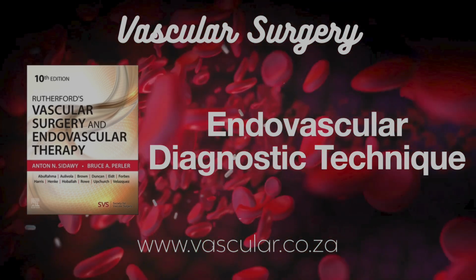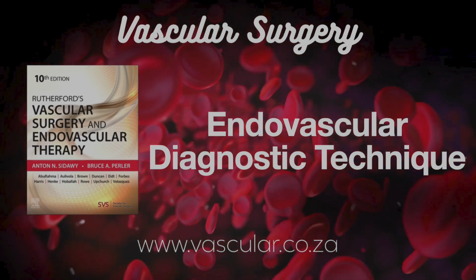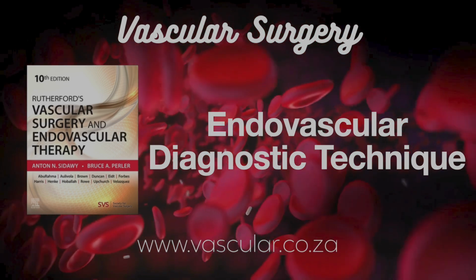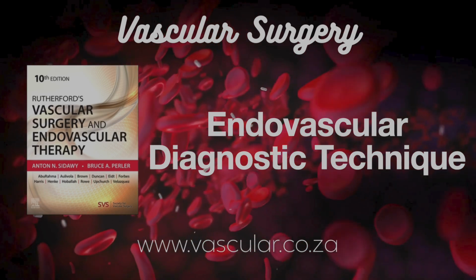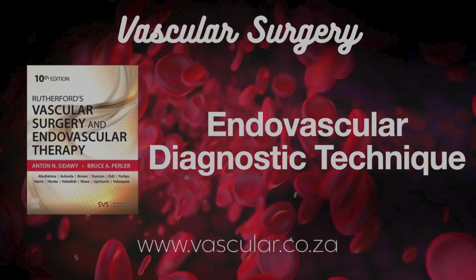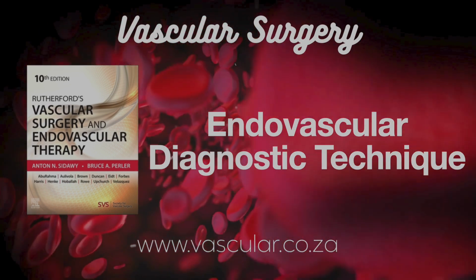Lots of shapes? Tons. Single curves for shallow angle takeoffs, maybe less than 45 degrees, like a Kumpe catheter for getting into the opposite iliac from the arm. Double curves for sharper, near 90-degree takeoffs. The renal double curve, or RDC, is classic for renal arteries. And reverse curves, almost 180 degrees back on themselves, for vessels coming off at a steep angle, like the aortic arch vessels from a femoral approach. Simmons 1 and 2 are common examples.